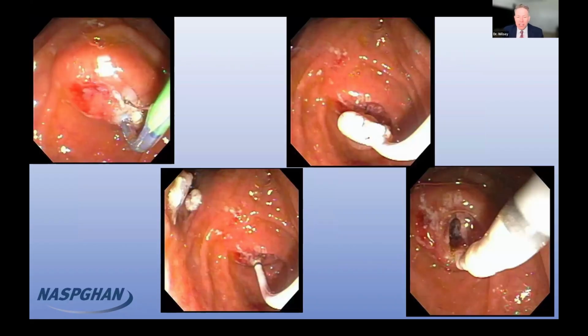When we do our surgery rotations, they don't mess with the pancreas unless they're having chronic pancreatitis, right? So then you have to relieve the obstruction. And these are several stones you can see in the top. And then on the bottom left here, we were able to reestablish the lumen. We put in a pancreatic stent.